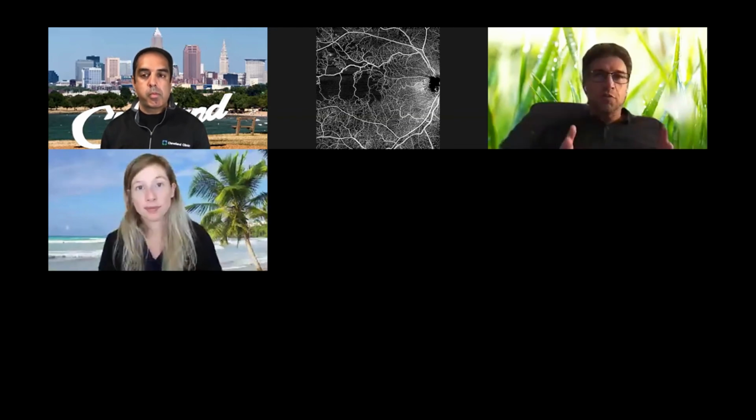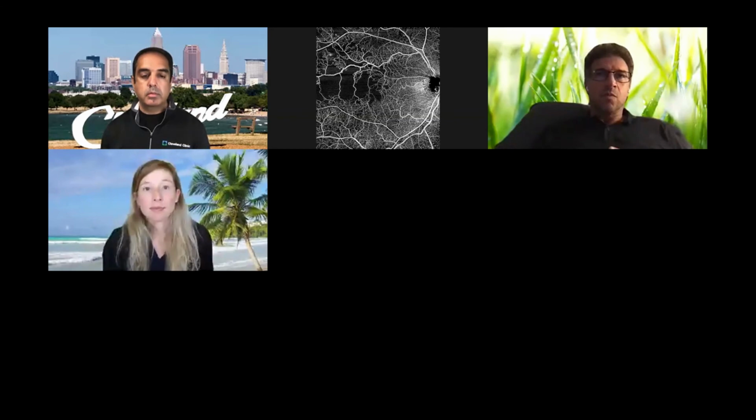That's what we use for small lesions, but for larger lesions we use the indirect ophthalmoscope with a 20 diopter lens. If the lesion fills the whole lens, that's 12 millimeters. Based on that, we estimate. And regarding the tumor thickness, we use the ultrasound, and for smaller lesions, we can use both ultrasound and OCT.